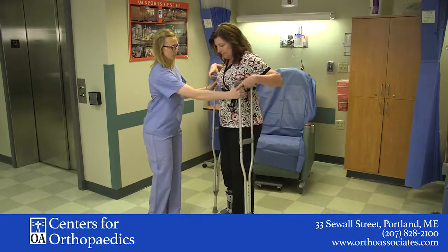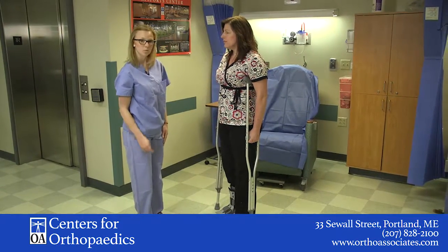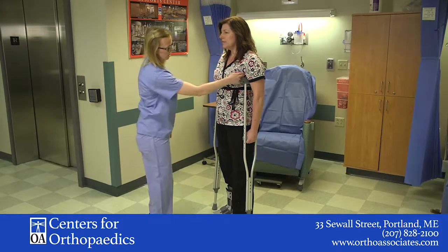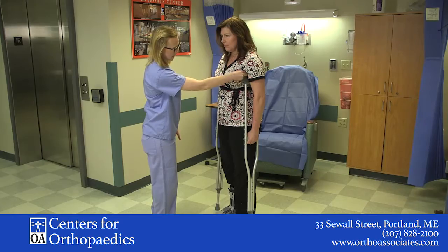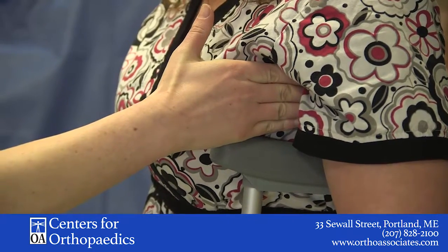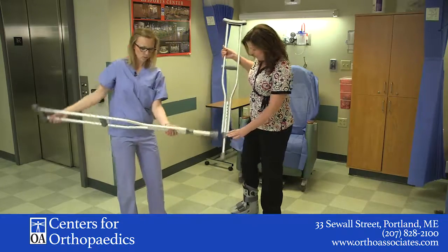So the first thing you want to do is place the crutches underneath the arms. You want to make sure that you can fit about two fingers underneath the armpit — between the crutch and the armpit. I could probably fit quite a few fingers under here, so we're going to make the crutch go up just a little bit — up one level here.